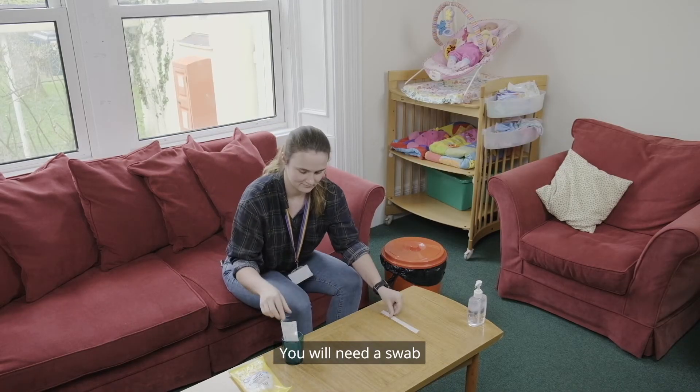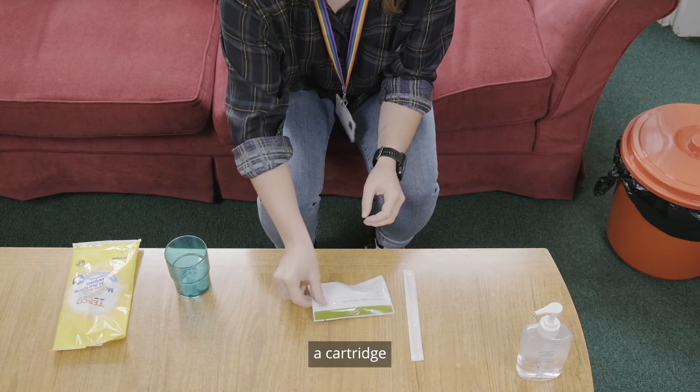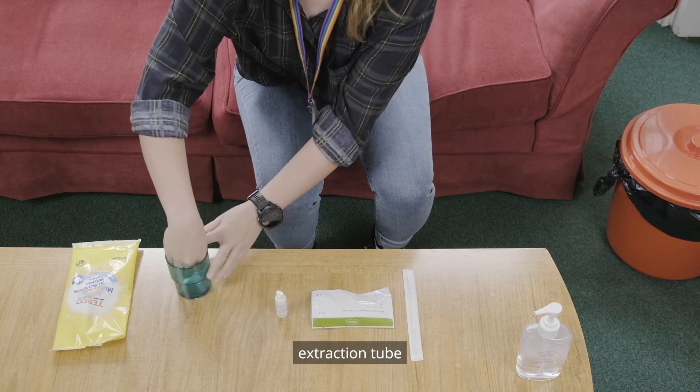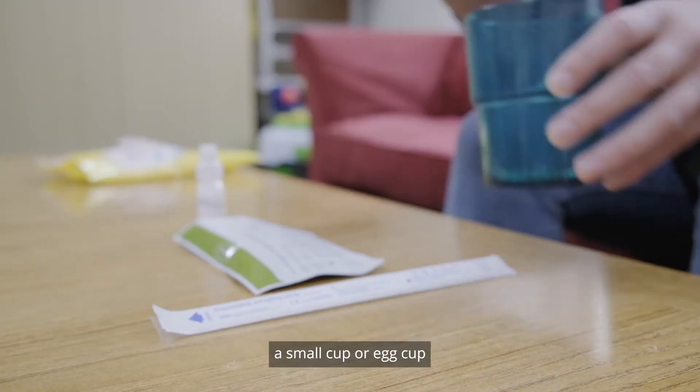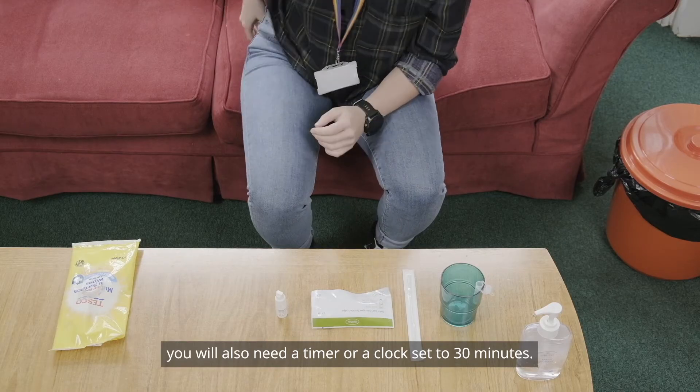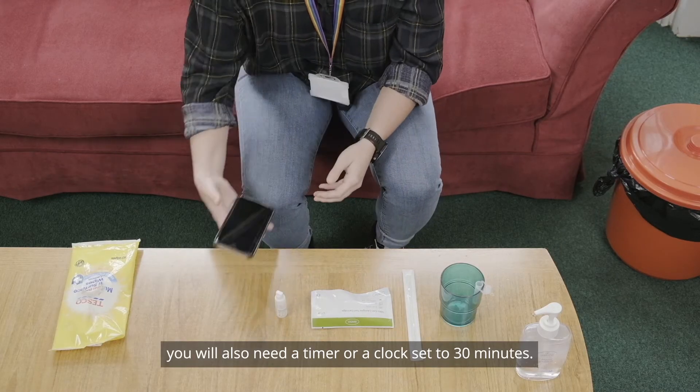You will need a swab, a cartridge, buffer solution, extraction tube, and a small cup or egg cup. You will also need a timer or a clock set to 30 minutes.